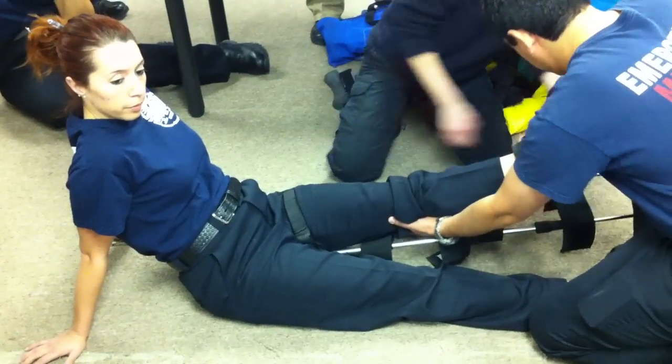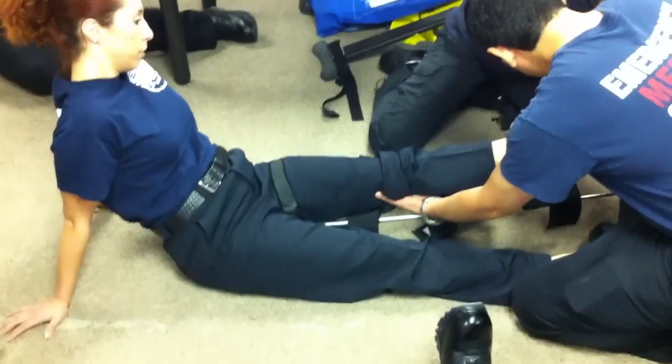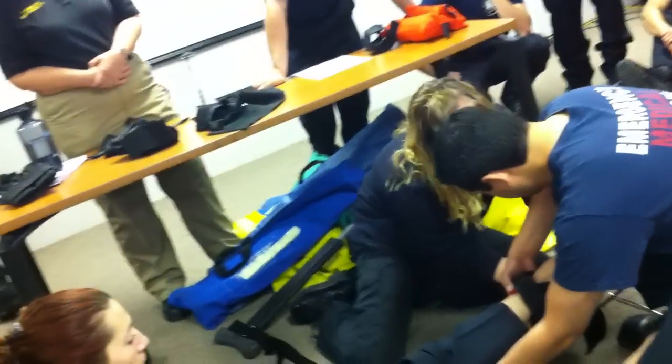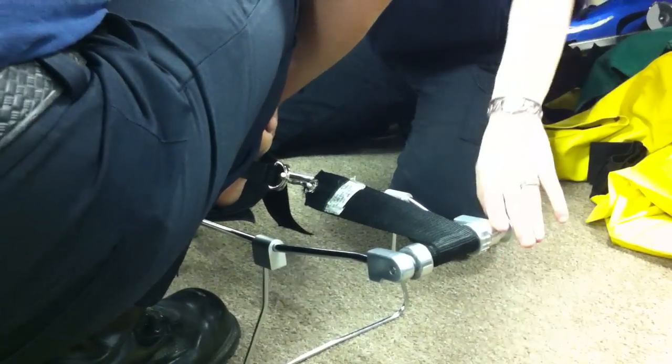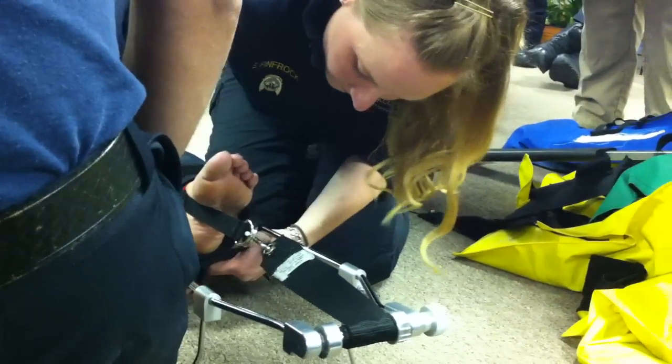Attaches ankle hitch or strap to the traction device and applies traction using the device. Okay, ankle hitch tied up. Full traction. It's just a little lever. We're going to pull until they feel relief. What if they scream? Wouldn't that hurt? Yeah, they're probably going to scream, and they're screaming before you do this. They're going to be screaming a whole lot. Okay, and secure support straps.